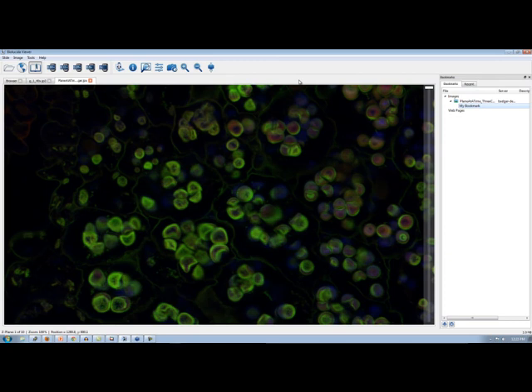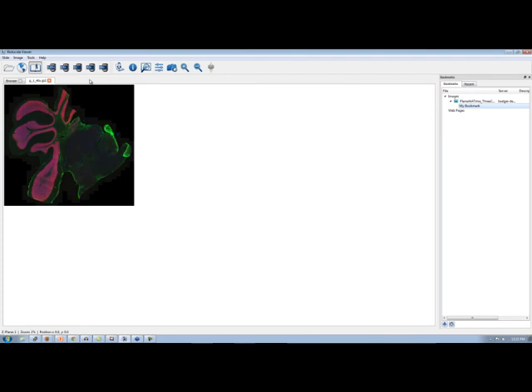If this was 3D virtual tissue, the student could go through, audit the hippocampus, place bookmarks where they found cells of a specific morphology, and then the PI or the graduate advisor can sit down with the student later and just have this list of where all those cells were. That would be akin to having a real piece of tissue with markers or flags where the cells are at.